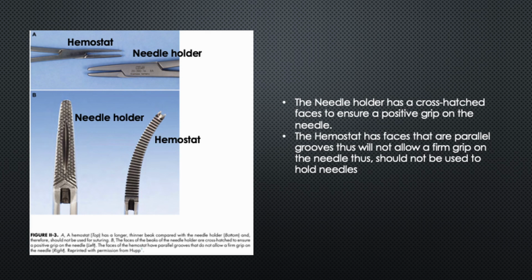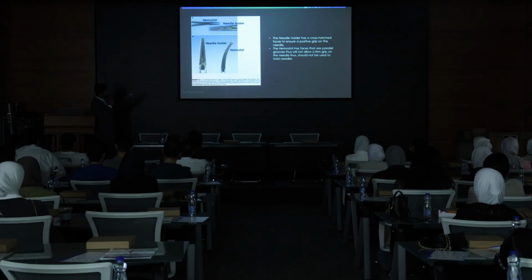Therefore, it's not going to form a firm grip on the needle, so it shouldn't be really used because the needle might slide. Also, you could appreciate that the hemostat is a little bit thinner and longer. It might be curved sometimes.